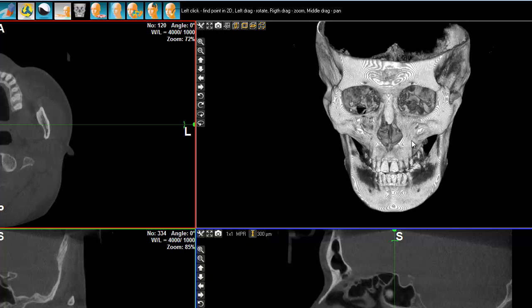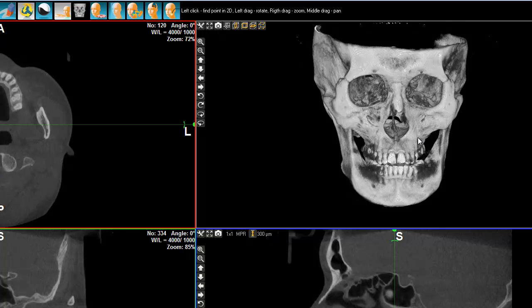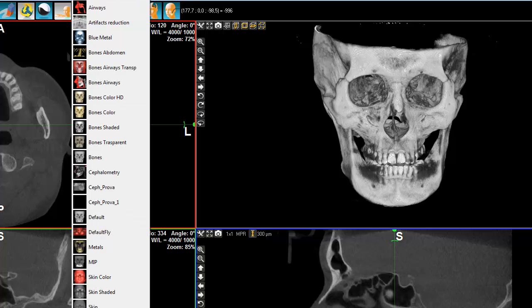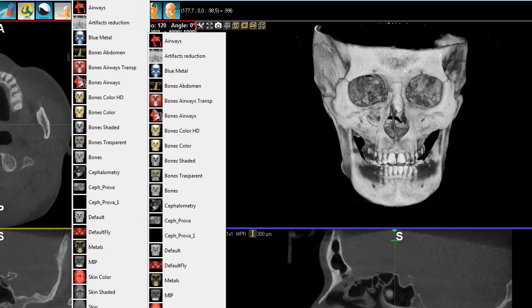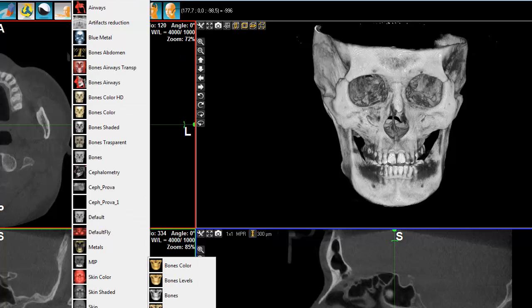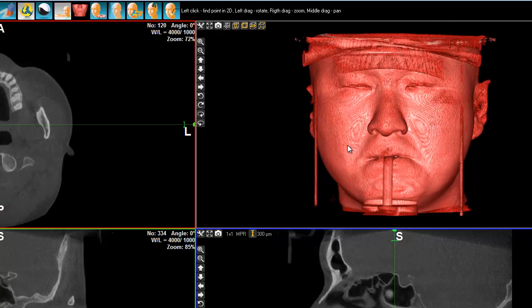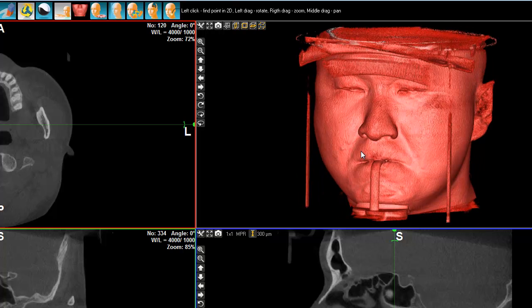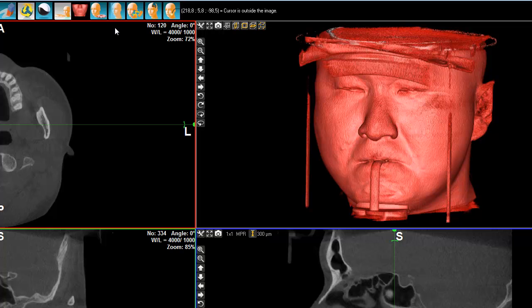This is where the 3D function is quite useful. Let's first choose soft tissue. There we can see our patient, and the idea in the next step is to see how good the Sinus is.